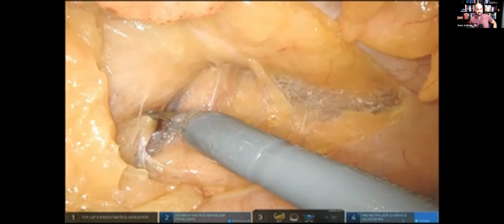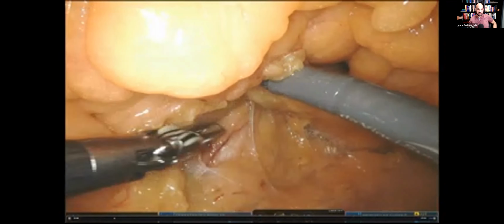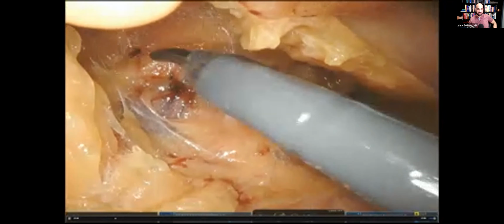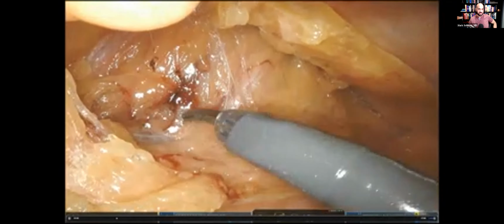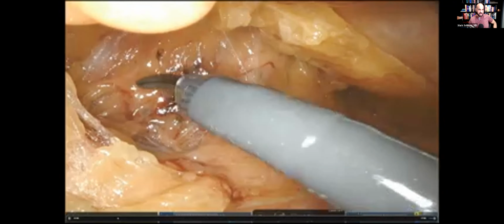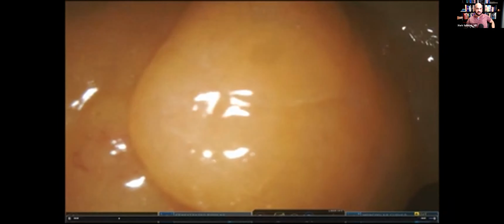The surgical tenets are exactly the same, of course, and the strategy also exactly the same. Left hand, poke, spread, lift, lifting up towards the head, brushing all this areolar tissue down. You can see this is a larger patient. I'm having a little more difficulty finding the left ureter, but it's up here. I can see it coming into view. And once I find it, then I know exactly I need to stay on top and everything else goes down.